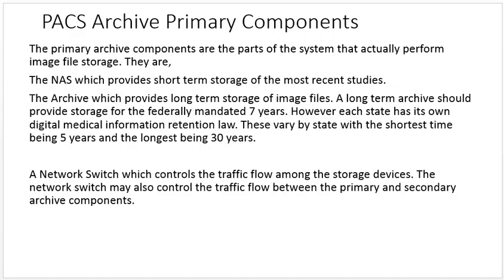The PACS archive primary components are the parts of the system that actually perform image file storage. They are the NAS, which provides short-term storage of the most recent studies, and the archive, which provides long-term storage of image files. A long-term archive should provide storage for the federally mandated 7 years. The federal government says you've got to store images for 7 years. However, each state has its own digital medical information retention law, and these vary by state, with the shortest time being 5 years and the longest being 30 years.